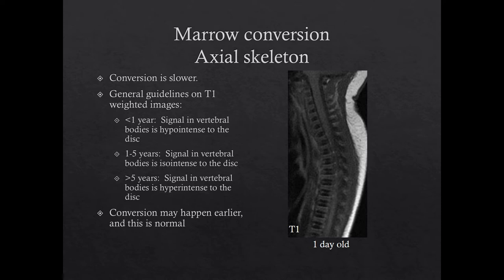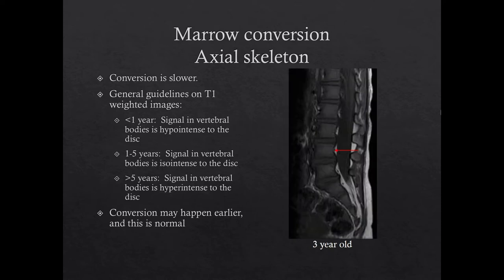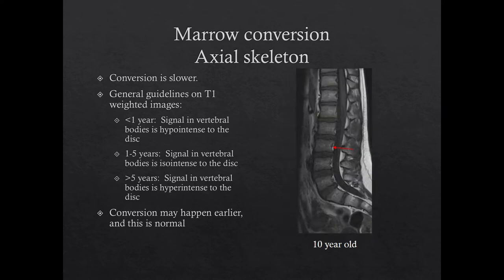Here you can see the vertebral body signal is hypo-intense to the adjacent discs in this one-day-old. Note that often the signal you are seeing in the region of the disc may include the disc and the adjacent unossified cartilaginous end plates depending on the resolution of your scan. In this three-year-old, the marrow signal is now of higher signal than the adjacent disc, and even higher in signal in this 10-year-old.